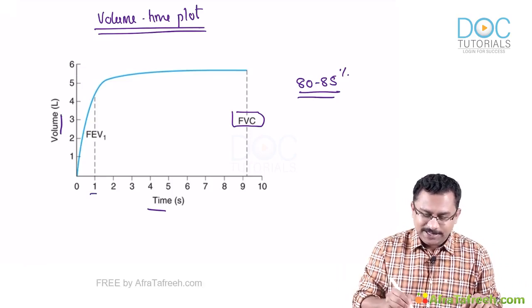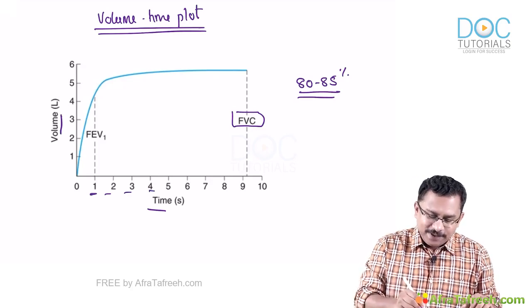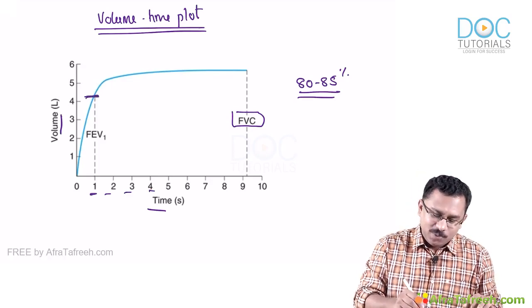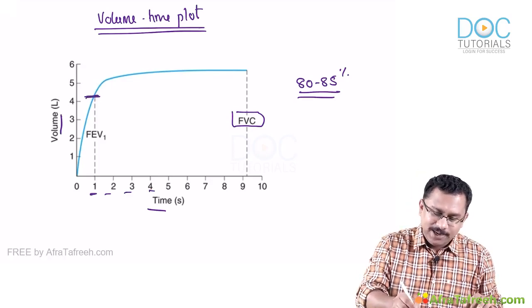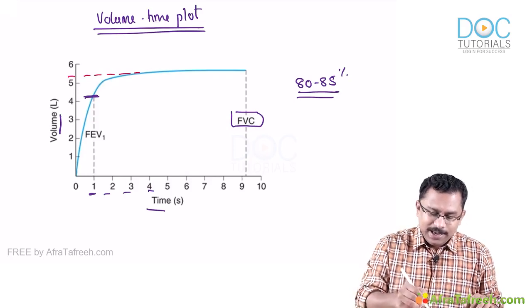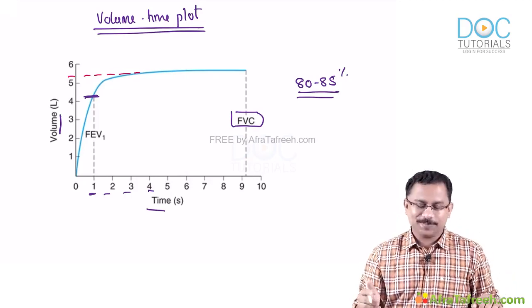As you can see here, this is the time in seconds. By the first second itself, you have almost reached the maximal height, which I am marking in red, and the violet is almost 80 to 85 percent.